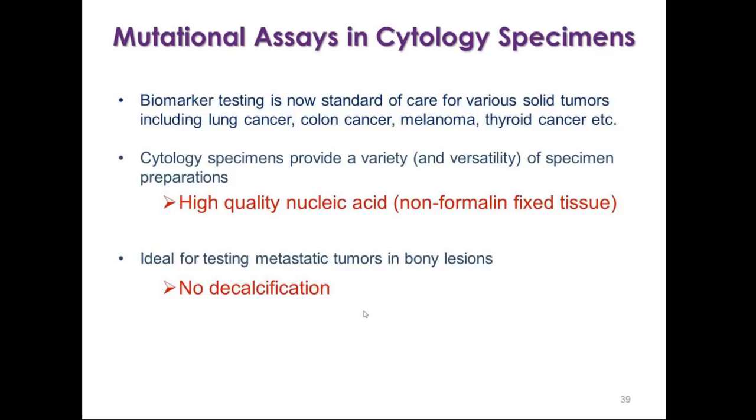So, for example, you have a bunch of different specimen preparations that are not formalin fixed, so you get really high quality nucleic acid. And as I mentioned before, your cytology specimens are not decalcified, so they're really ideal for testing in bony lesions.